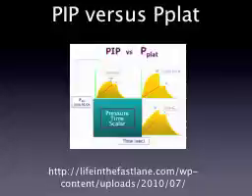However, if my PIP is elevated and my P-plat elevates right along with it, and you can see on the bottom right there the low compliance, both the PIP and the P-plat are elevated together, and there's very little difference between the PIP and the P-plat. This indicates a lung parenchyma problem, or an alveolar problem, to be more exact, an alveolar lung compliance. Chest wall compliance as well, in some cases, but generally we're talking about within the lung itself. This can be things like ARDS, pulmonary fibrosis, possibly circumferential burns of the chest, and so on.